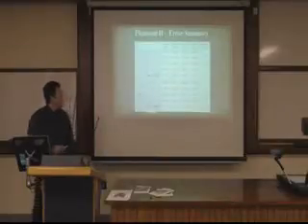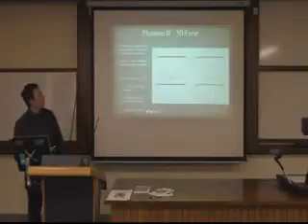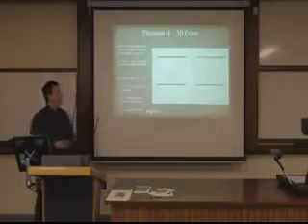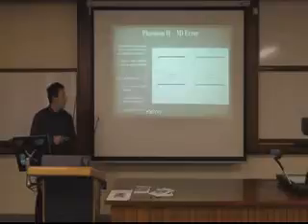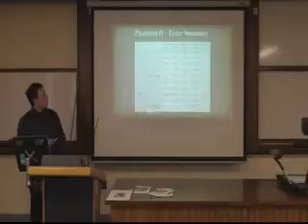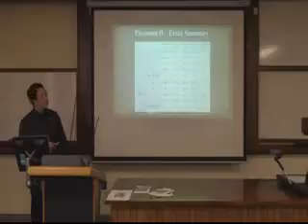And so for Phantom 2, oh, by the way, there are actual error bars on here, because we did 3 separate runs of each experimental setup, so that we could evaluate not only was it accurate, but was it consistent in what it was outputting. And so the error bars are insignificant, you can't even see them on this sub-millimetre scale. Each coordinate was analysed, but I only plotted 3D, because that sort of sums it up. And you can see the standard deviation, talking about very small results. Maximum error always occurs at the start of the plot as the convergence is happening. And the detection success of 94.6%.